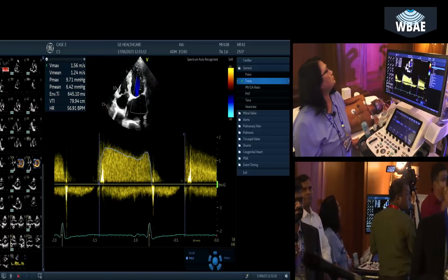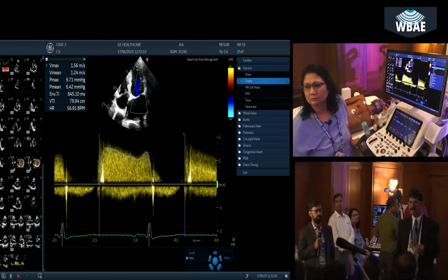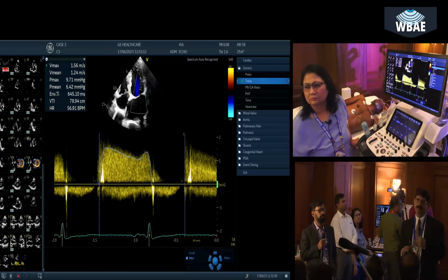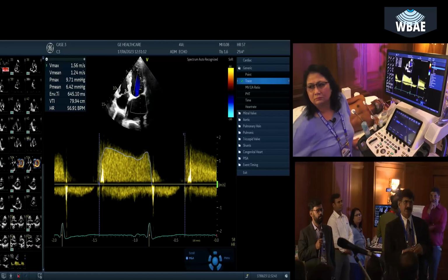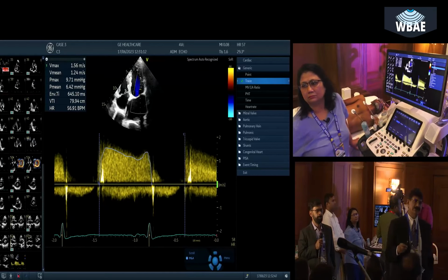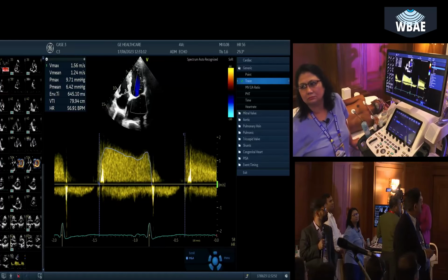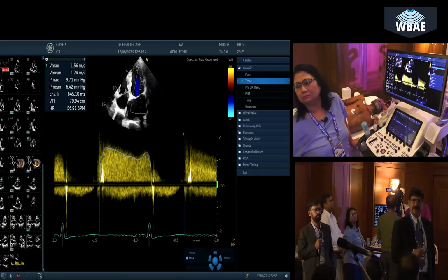You know, what we call low gradient mitral stenosis is there in almost 40% of cases. Patricia Pellikka wrote an article on calcific mitral stenosis, but in rheumatic heart disease also we see low grade mitral stenosis quite often, and the reason is the stroke volume is less. So I will tell you what would be the stroke volume of this lady. She has an 80 VTI. She has a stroke volume of 50. 50 divided by 80 gives you the area. Or let us say 55 divided by 80. You are getting about 0.7 as the area.